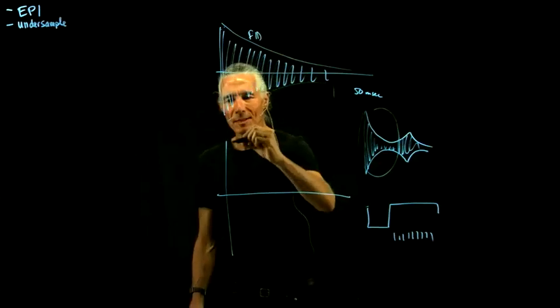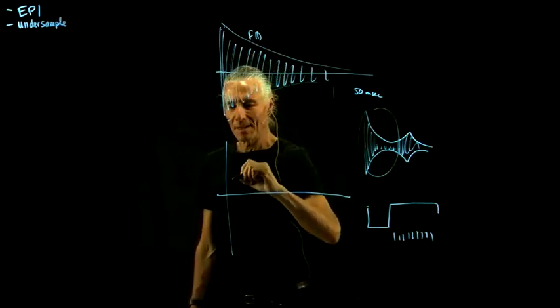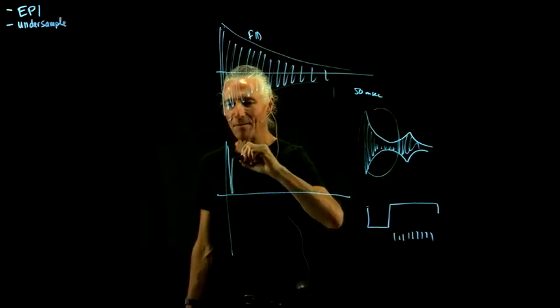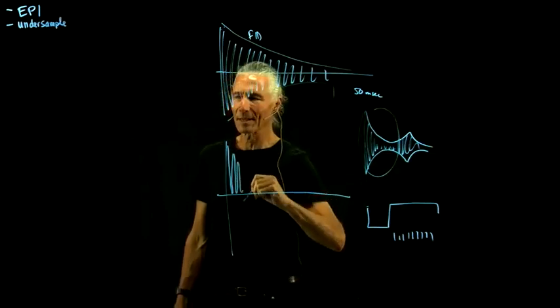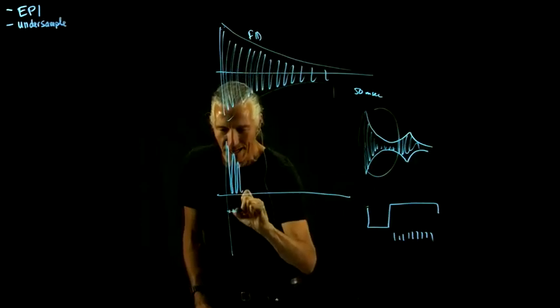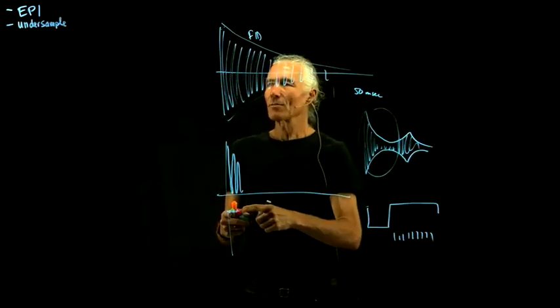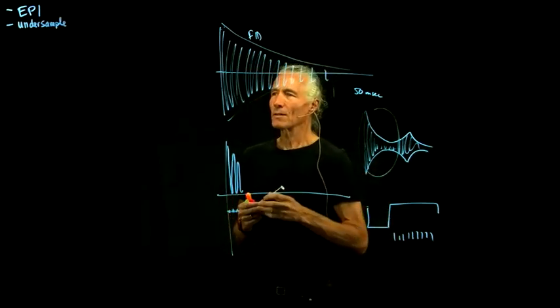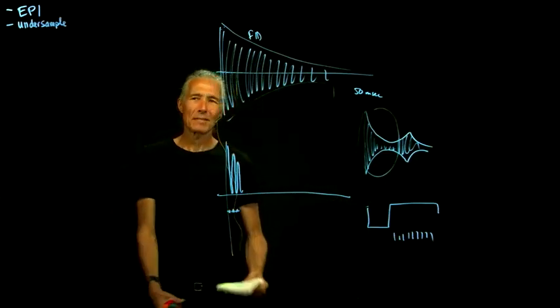What we could do is, virtually as soon as the FID starts, immediately slam the gradient on all the way, and then reverse the gradient the other way, and slam it on the other way, and then reverse it again, and slam it on the other way. Each one of these makes an echo like that. So you're essentially collecting all of the echoes, like 64 echoes, that we need in order to collect all the k-space data for one slice. So that's, in words, what Echo-Planar Imaging is.